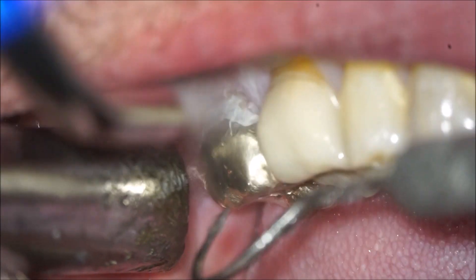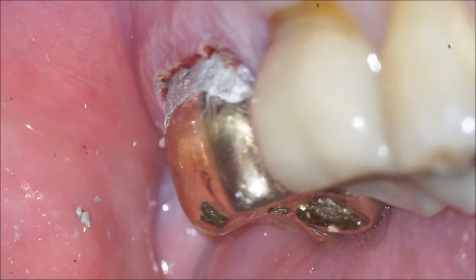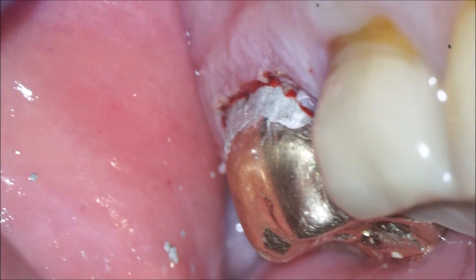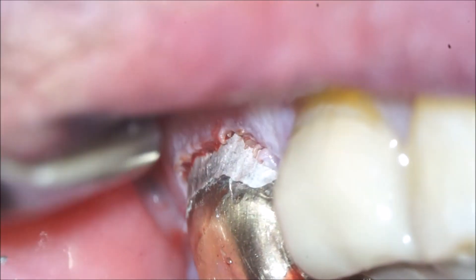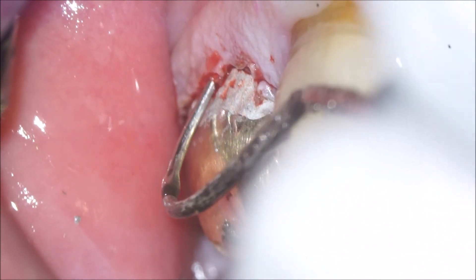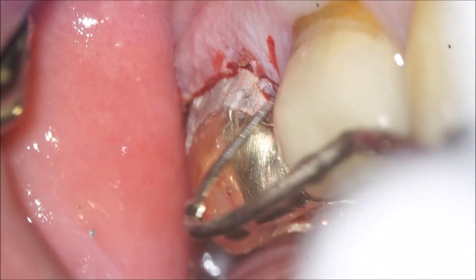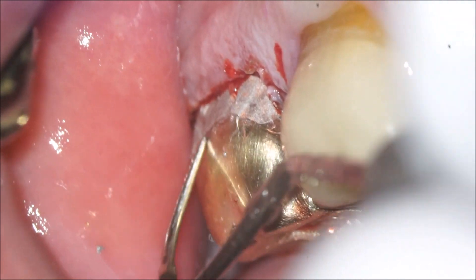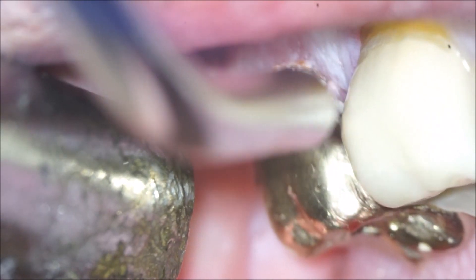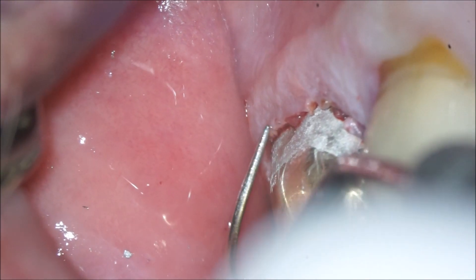This is looking good. We've got our final burnishing done. There are no overhangs on the amalgam, and if we look here with a close-up view, you can see everything is looking really smooth in transition. If you want, at this point you could take a wet cotton pellet and do some final burnishing of this amalgam. I'll do some final exploration with the explorer tip to make sure I didn't leave any possible pieces down there. Usually I'll come back after this is set a little more and smooth it with my finger or a wet cotton pellet — both of those tend to burnish it up really nicely. That should complete the restoration — a pretty quick job. I hope that was helpful if you're doing any amalgam patch jobs.